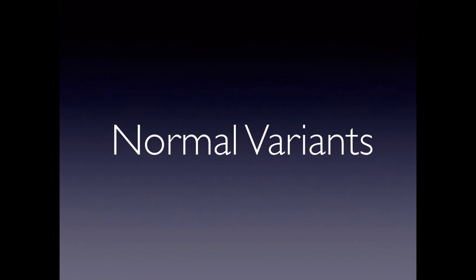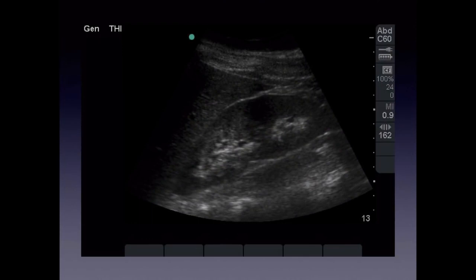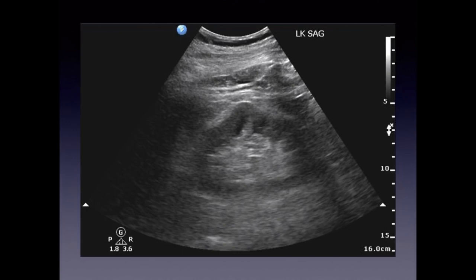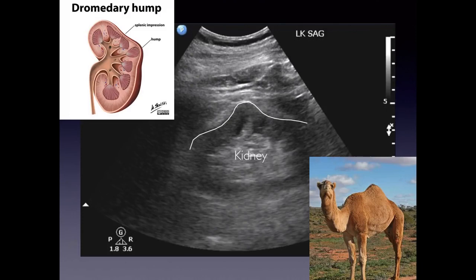There are a couple of normal variants to be aware of. A dual collecting system appears as a break or space within the renal sinus. A dromedary hump is a normal contour variant seen on the left kidney where the kidney appears to bulge upward like a camel's hump — this is related to the kidney fitting up against the spleen on the left side.